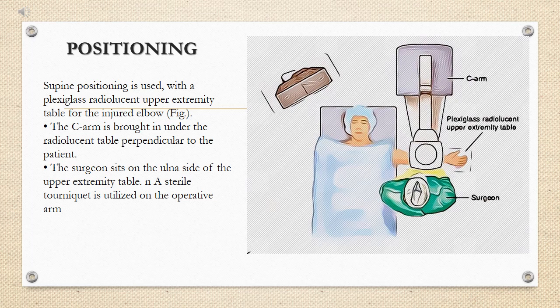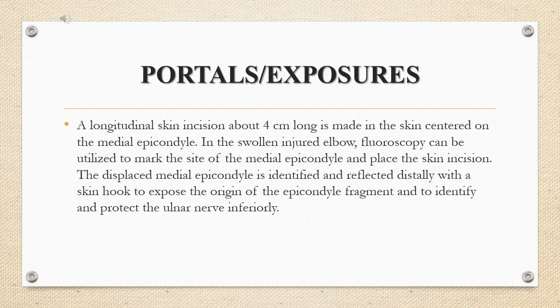Supine positioning is used with a plexiglass radiolucent upper extremity table for the injured elbow. The C-arm is brought in under the radiolucent table perpendicular to the patient. The surgeon sits on the ulnar side of the upper extremity table. A sterile tourniquet is utilized on the operative arm. A longitudinal skin incision about 4 cm long is made centered on the medial epicondyle. In the swollen injured elbow, fluoroscopy can be used to mark the site of the medial epicondyle and place the incision. The displaced medial epicondyle is identified and reflected distally with a skin hook to expose the origin of the epicondyle fragment and to identify and protect the ulnar nerve inferiorly.